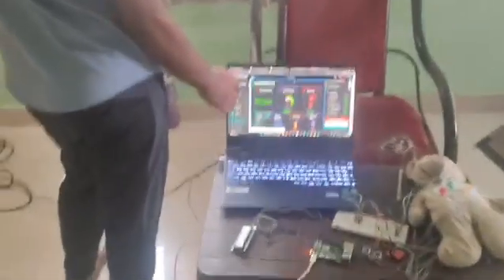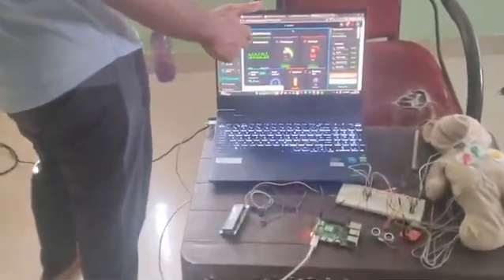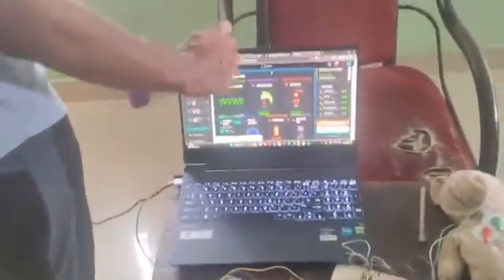We now talk about the dashboard and monitoring interface of the system. The purpose of the dashboard is to provide remote monitoring of patient health and display the real-time sensor data visually. It is accessible by the doctor or caretaker from anywhere. The dashboard features a live display of heart rate, body temperature, and movement status.